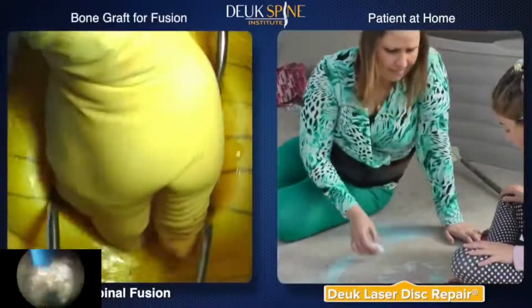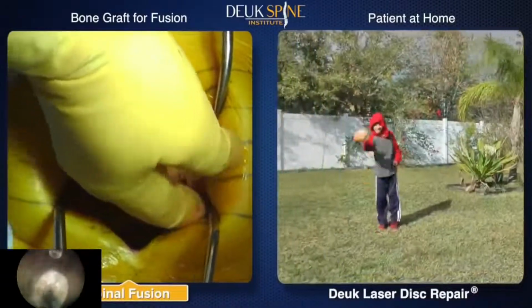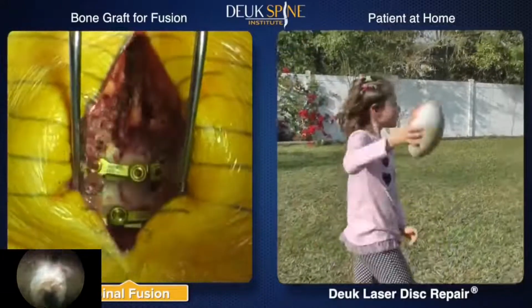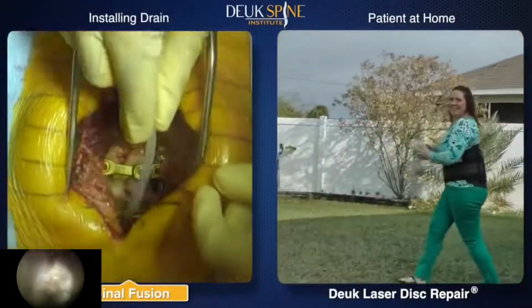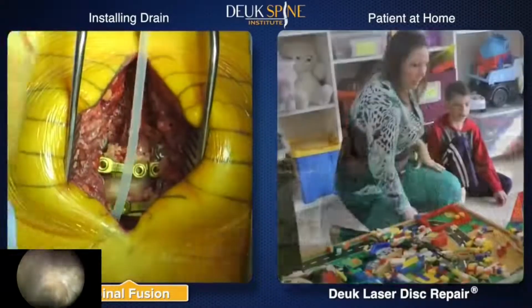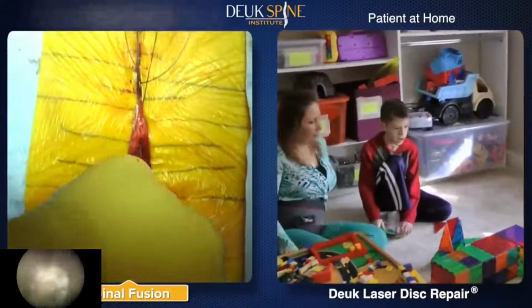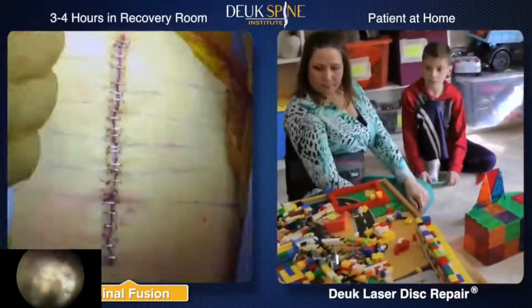Meanwhile, bone graft material is placed throughout the fusion surgery site. These morselized pieces of bone will eventually grow together to help promote the fusion process. Prior to closing the wound, a temporary drain is installed to allow excess fluid to drain. Average surgery time of a traditional 2-level fusion is 2.5 hours, with an additional 3 to 4 hours in the recovery room.